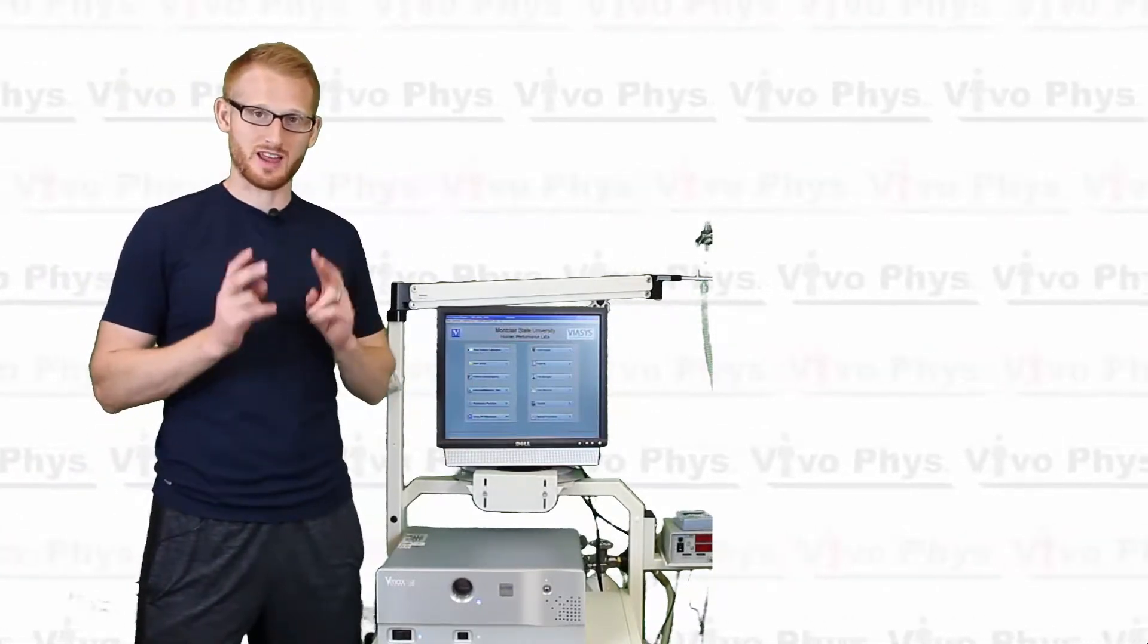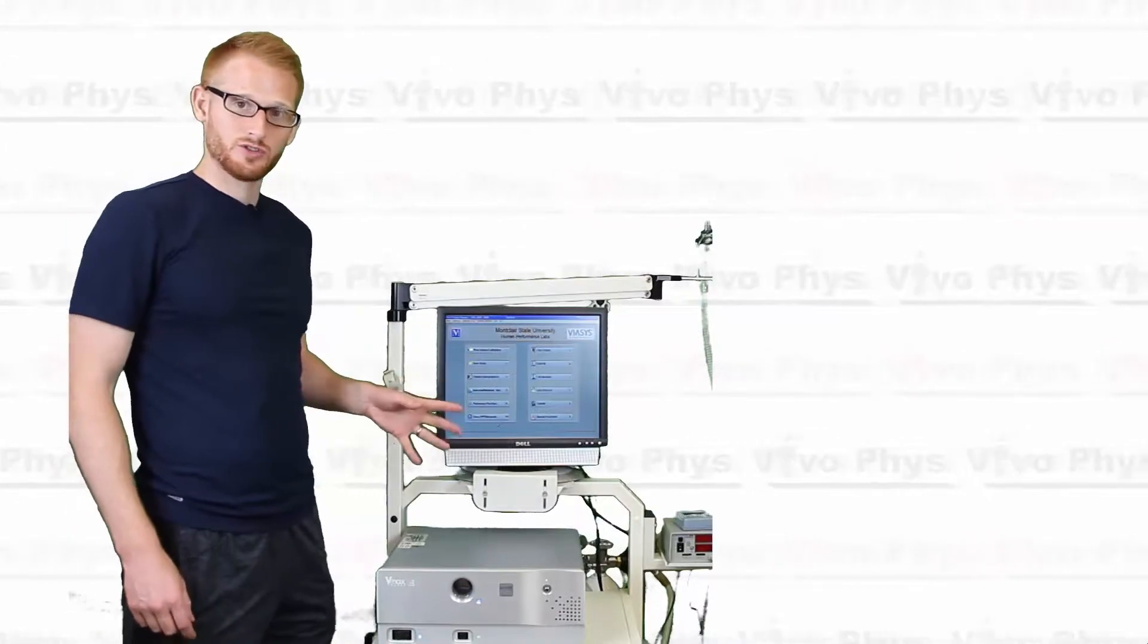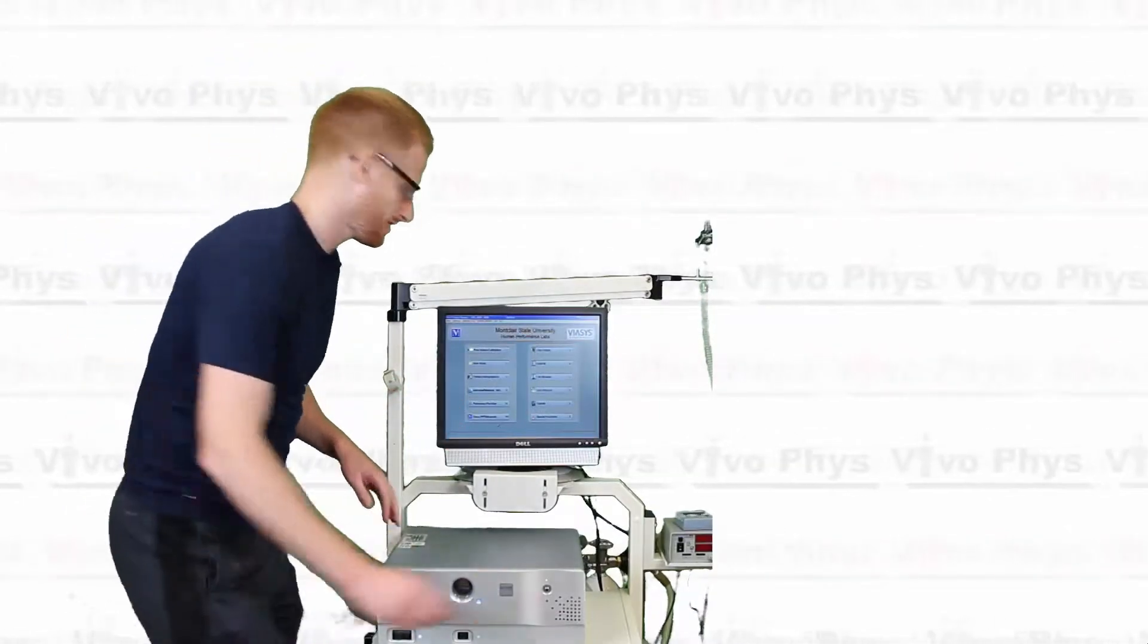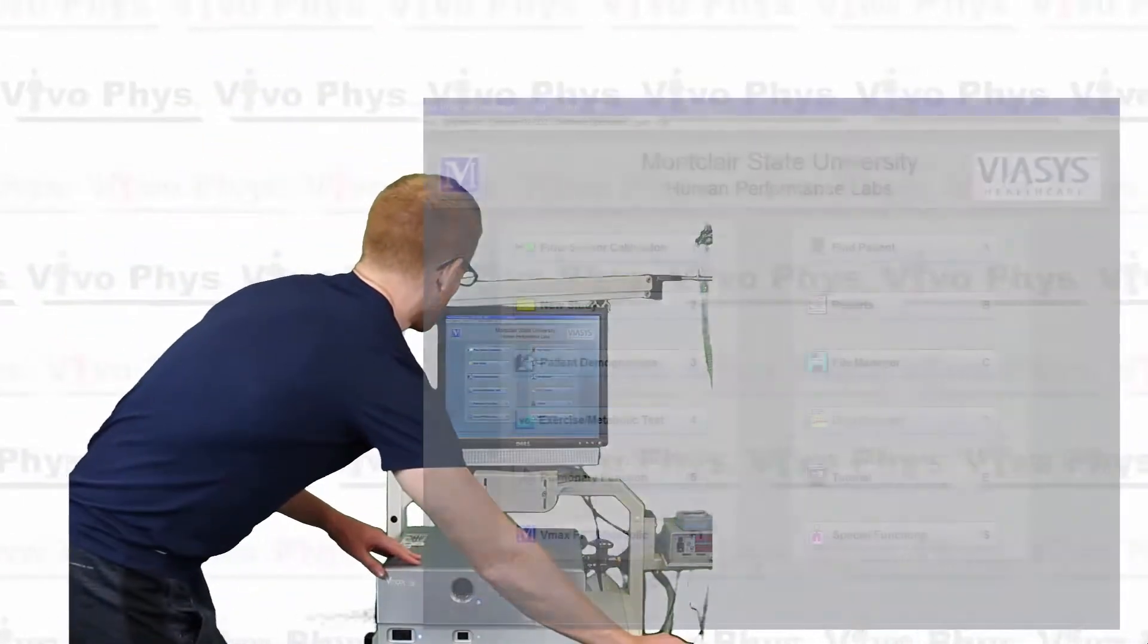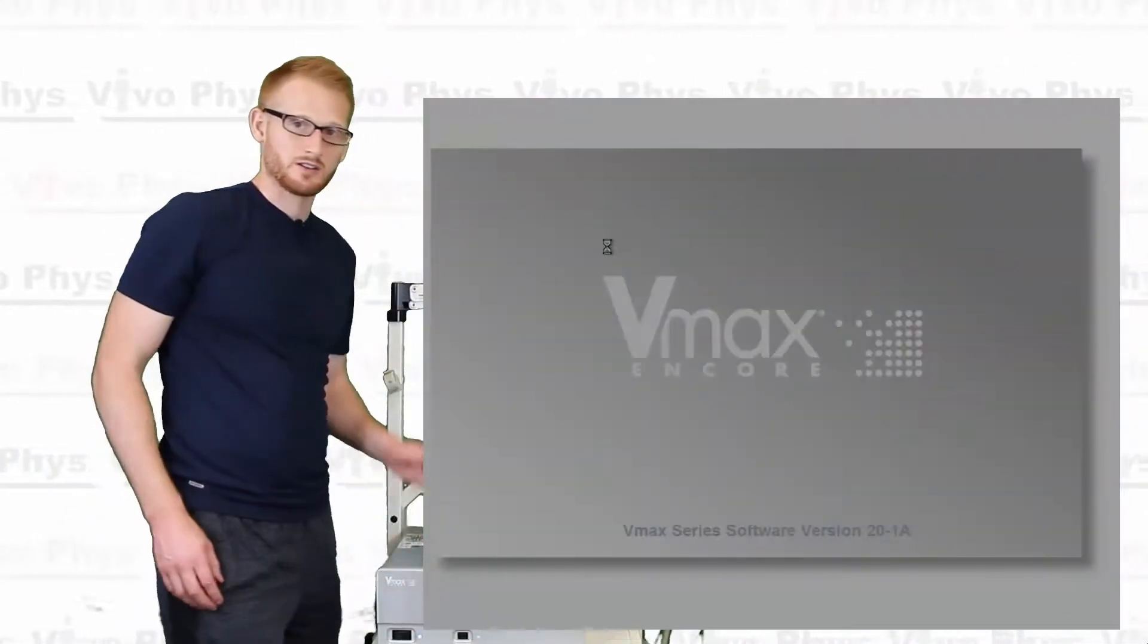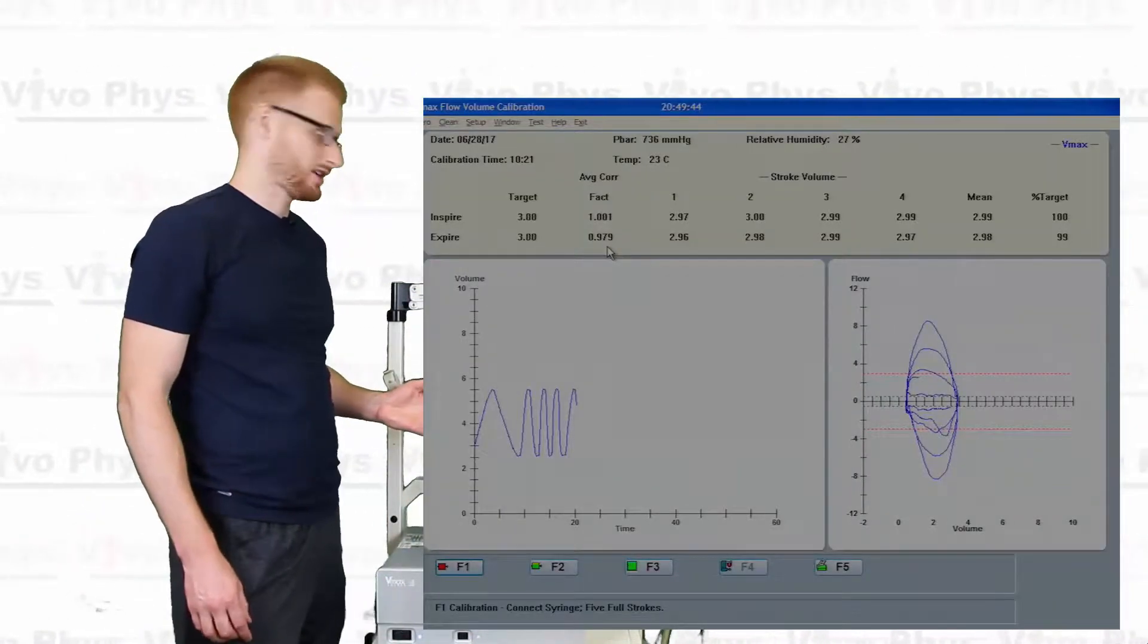So the flow should be what you do first, not the gas calibration. Alright, so there's two parts to this, gas and flow. Alright, so in order to do the flow calibration, we're going to come in here. We're going to click on flow sensor calibration, and you're going to see a new dialog come up here.